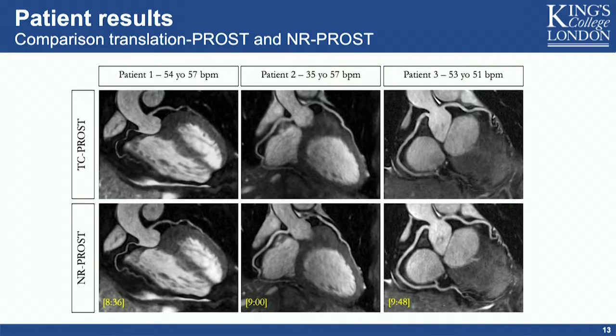Now, what about patients? Same observation. I'm showing you here 3 patients. On the top, translation correction only. On the bottom, non-rigid PROST reconstruction. And we see again an improved visualization of both RCA and LAD in a scan time here of less than 10 minutes predictable.